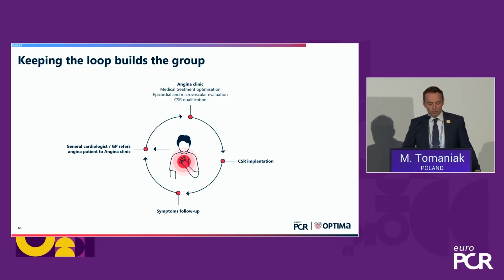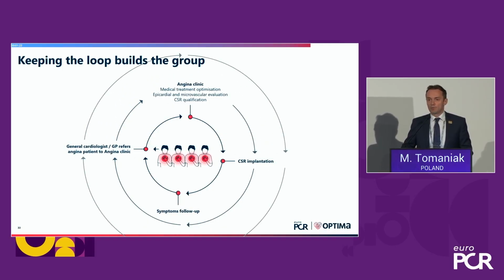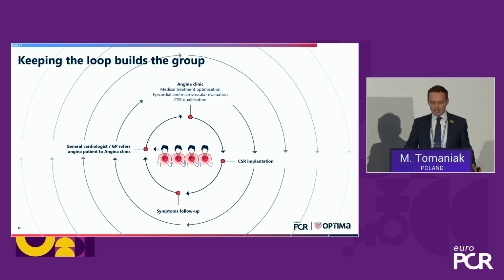It is routine for us to report both the acute result of the procedure, but also the 3-month follow-up with regard to the symptom relief, not only to the patient when we talk with him or his family, but it's important to each general practitioner, each general cardiologist that referred the patient to us.